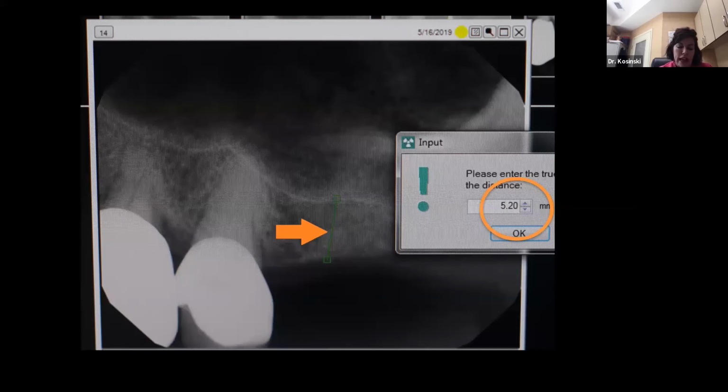So if we use the analogy of a nutcracker to open a nut, where do we put the nut? In the back part of the device. Same holds true here. We don't want to place an inadequately shaped implant in this area. Proper form and function must be considered.